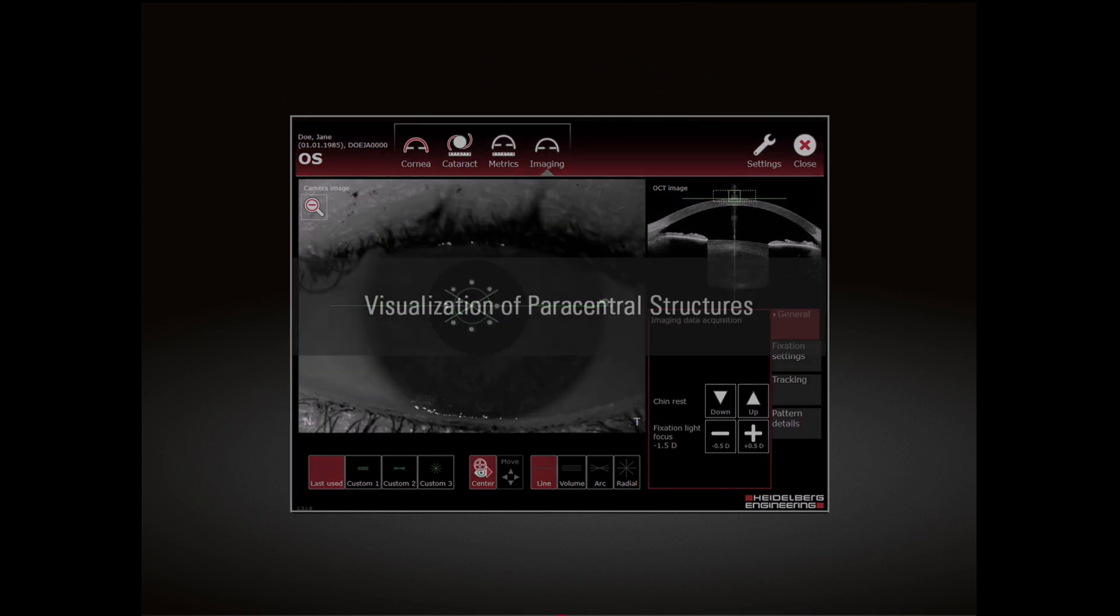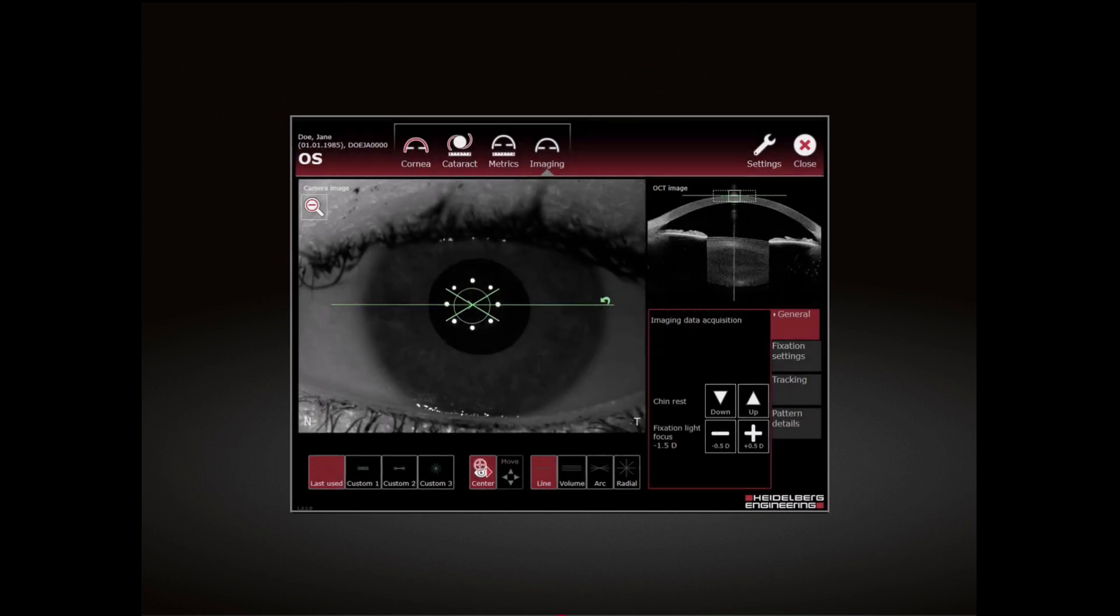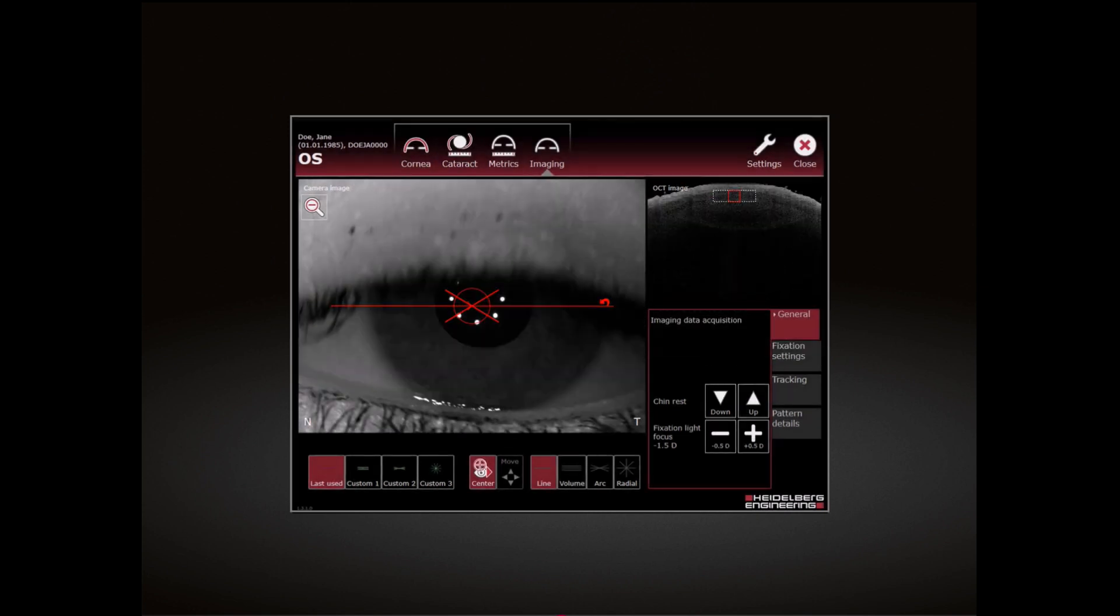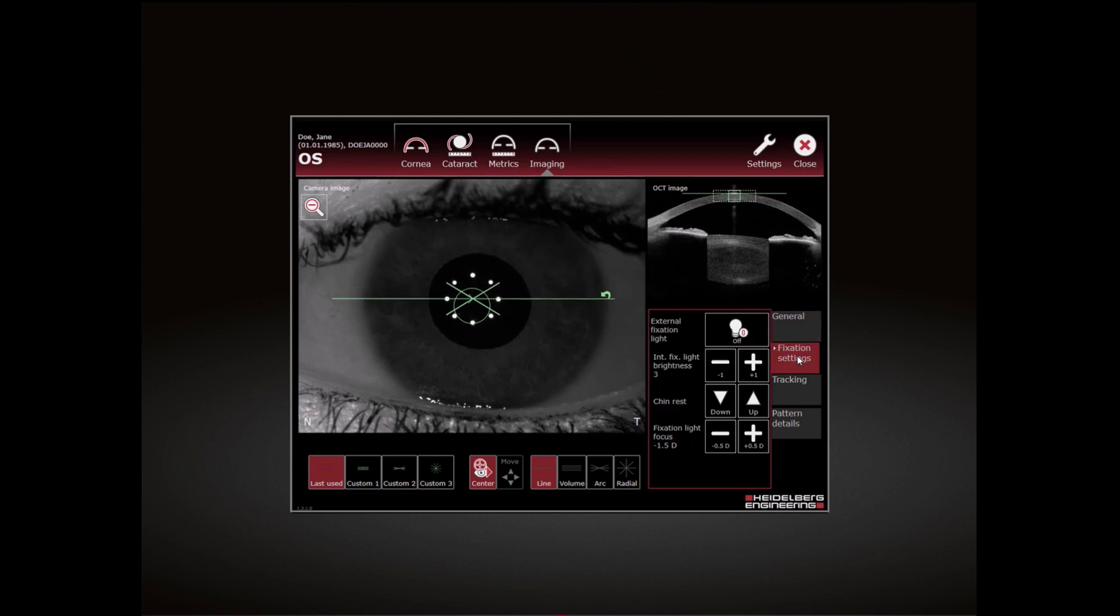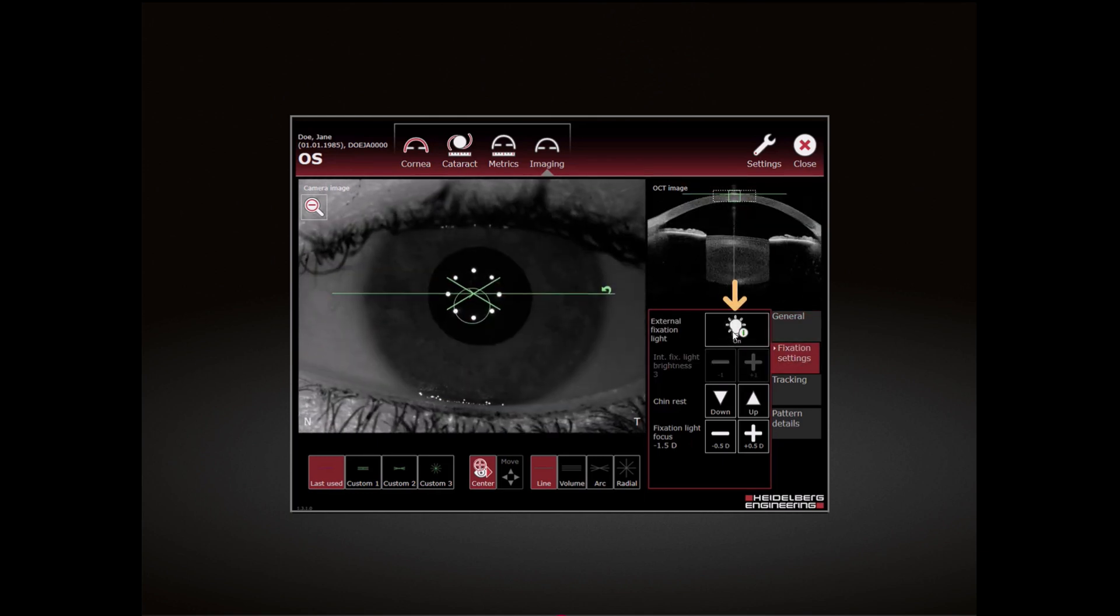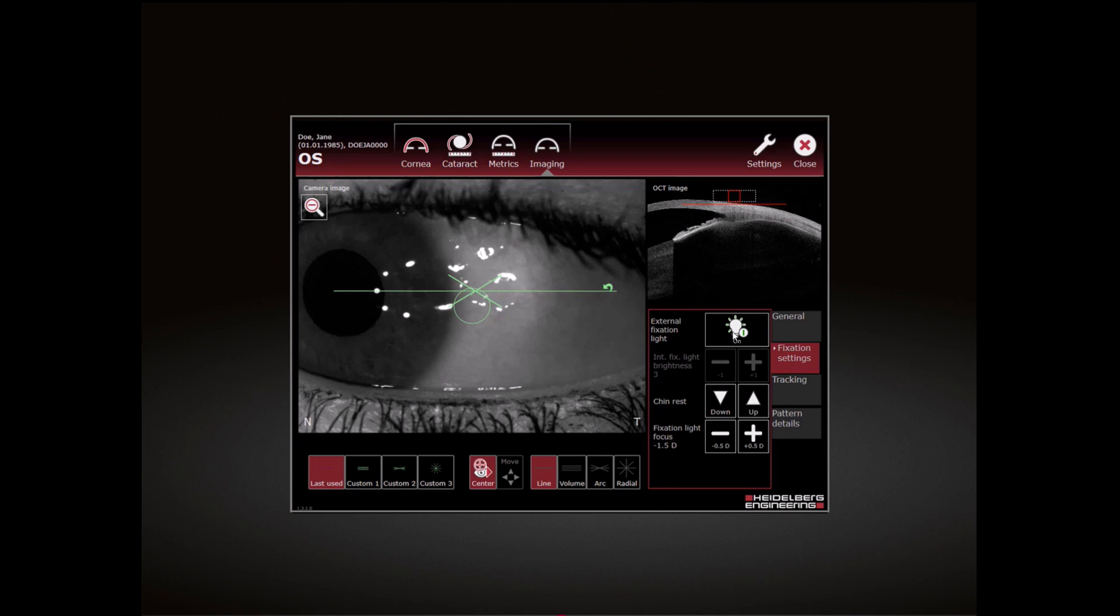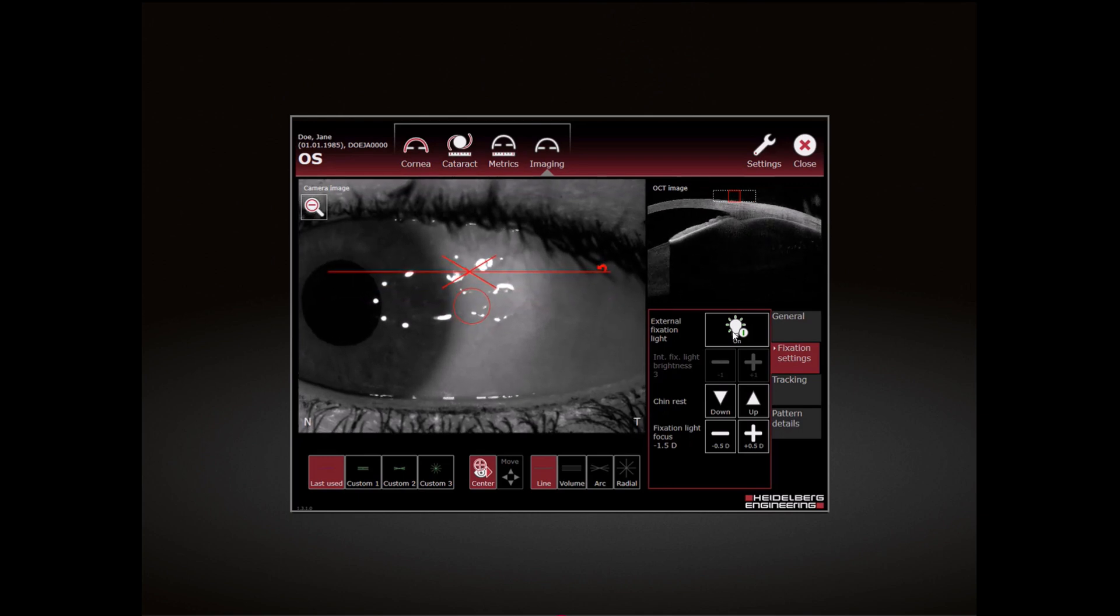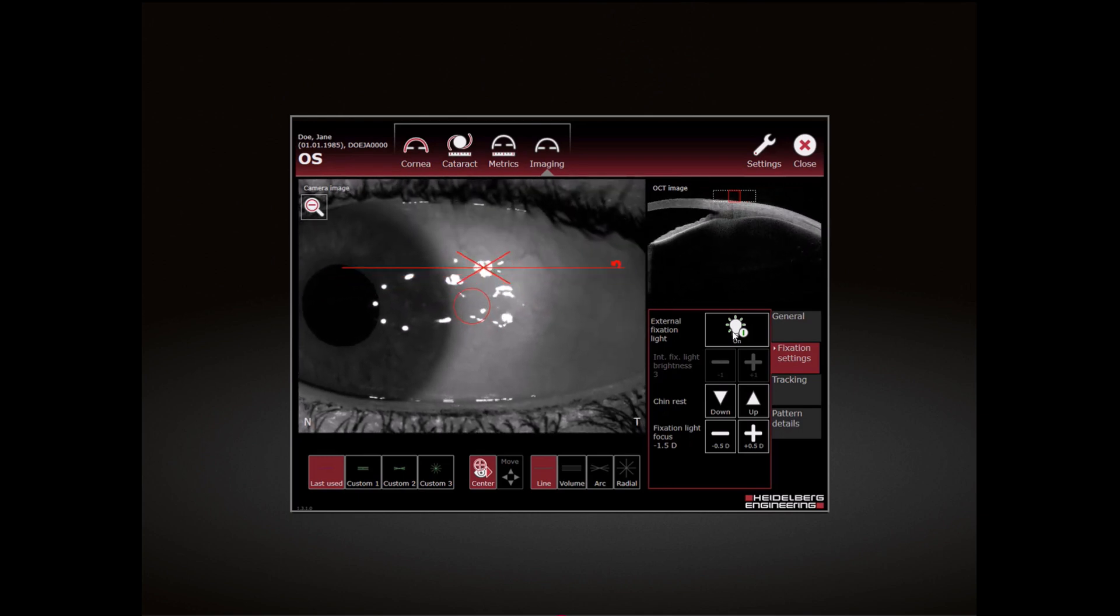Visualization of paracentral structures: Select the Fixation Settings tab. To switch on the external fixation light, tap the light bulb symbol in the external fixation light section. Move the external fixation light so that the fixation of the patient's fellow eye is achieved with the external fixation light.